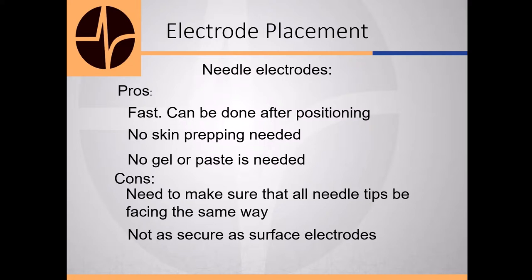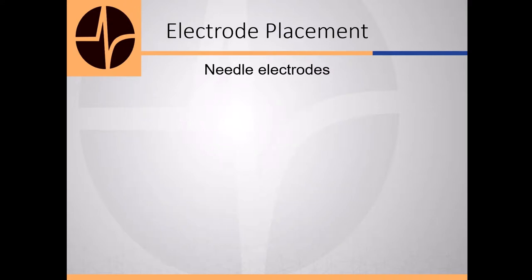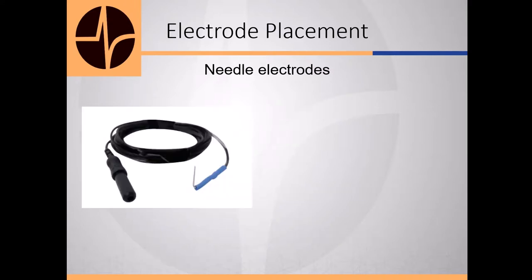They're not as secure as surface electrodes, as we all know, but I'm going to go over a couple ways that we can secure them. And we know that bleeding may occur. So this is a pre-bent needle electrode, and they stay in really nice.